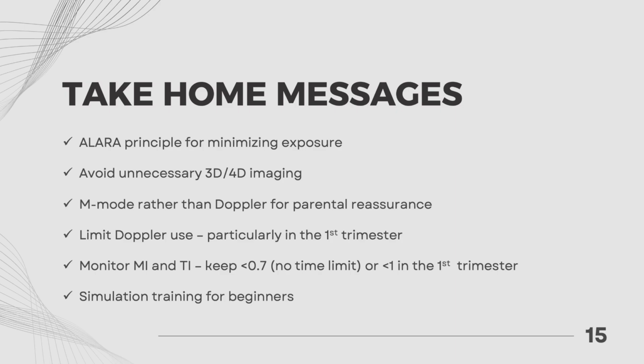Finally, simulation sessions are ideal for beginners so that only trained operators can scan patients, which reduces unnecessary exposure and ensures accuracy.